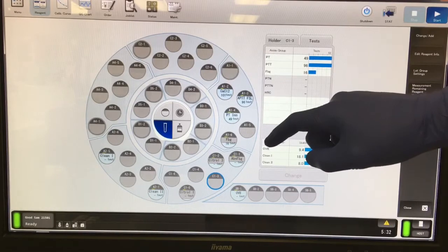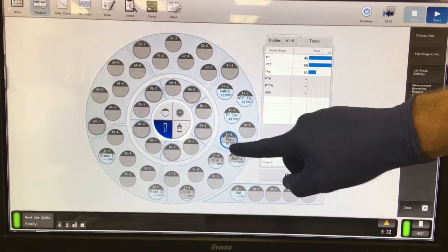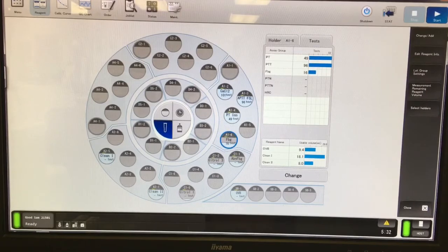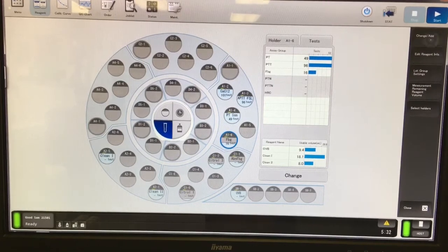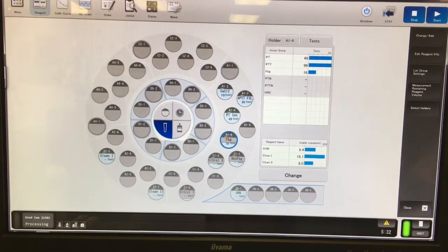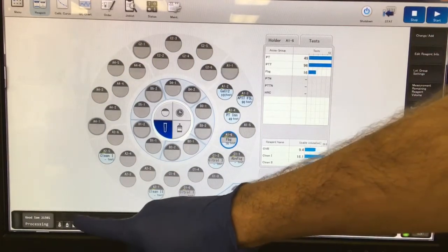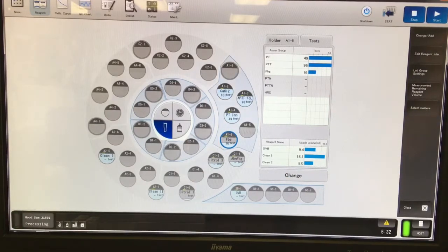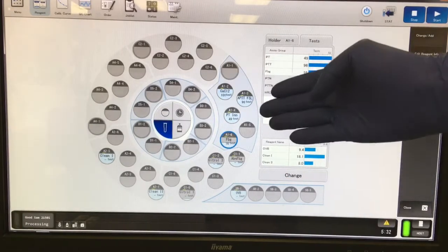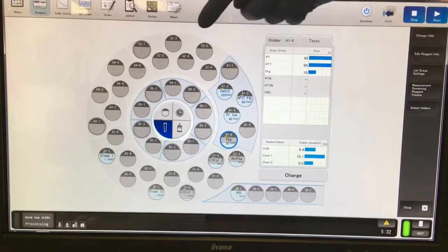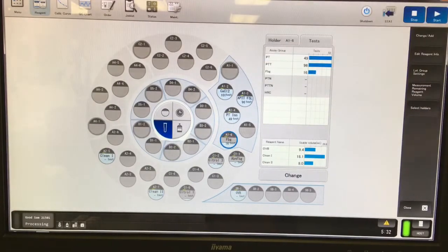Once you know what you want to change, go ahead and select that reagent, and then in the top right corner, click Change Add. This will rotate the analyzer racks to the appropriate ones so that you can extract it later, and you'll notice that it turns blue for the rack you've selected once it's in place.